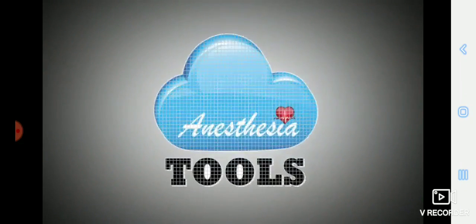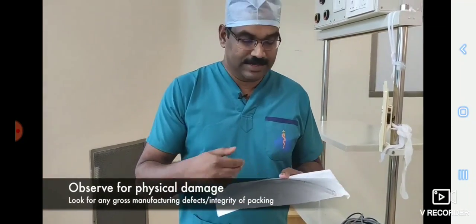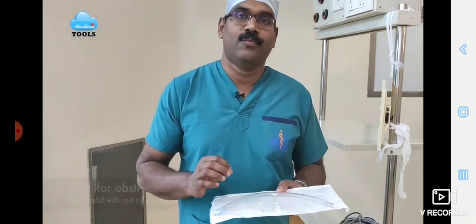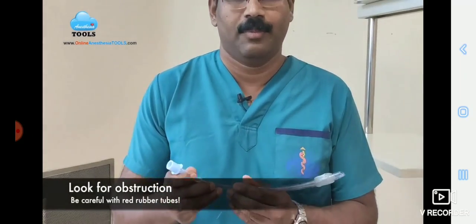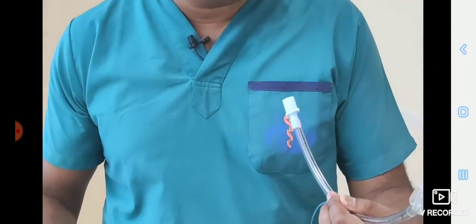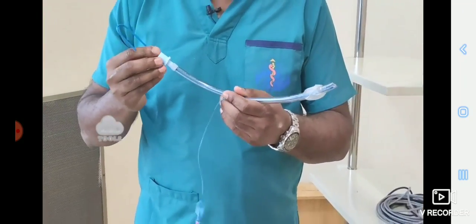Now we will see how we check the endotracheal tube before use. Initially, look for any physical damage like missing parts or kinking. Now look for obstructions. For a PVC transparent endotracheal tube, simple observation should be enough. But if it is a red rubber tube, which is not transparent, we have to look through both lumens, even use a stylet to see that there are no foreign bodies inside the tube.